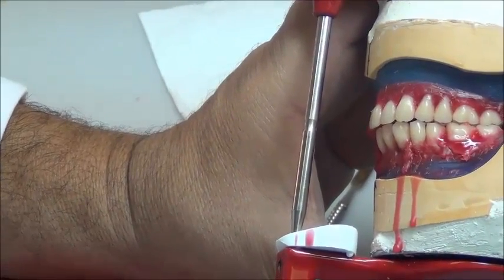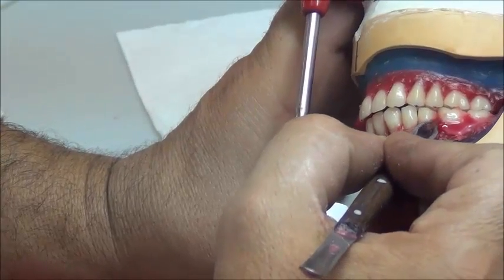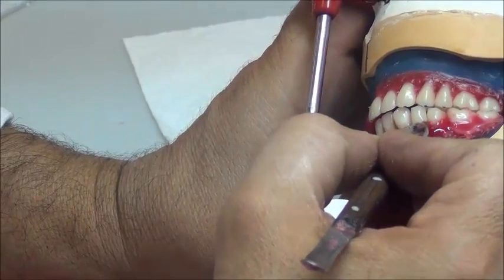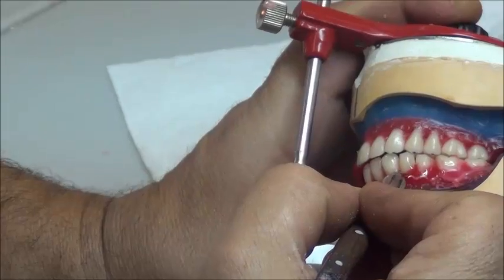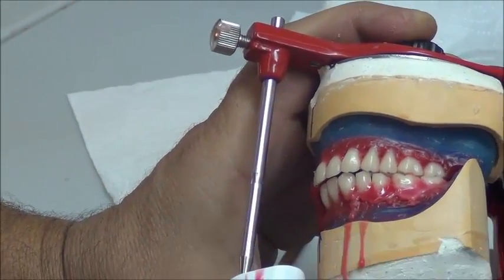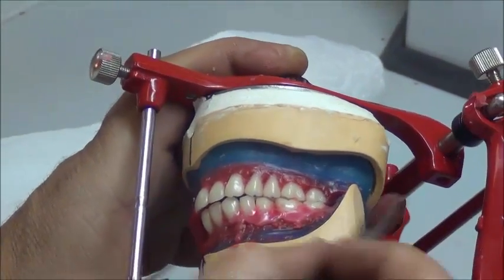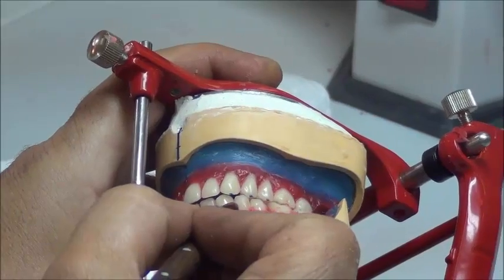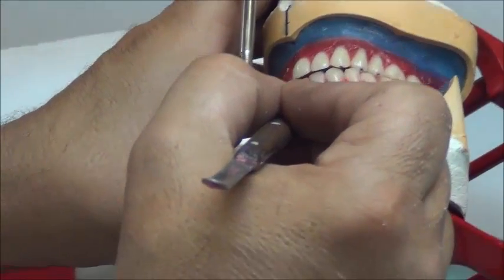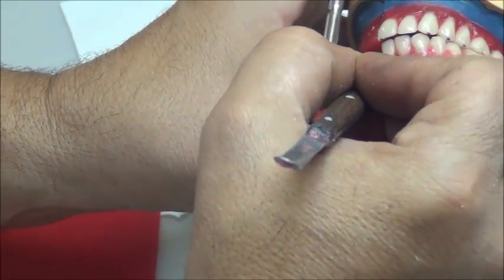Fix them into place securely with warm wax. Fill in the interdental papilla areas. Add more wax if needed. Clean the teeth and submit them bilaterally. All teeth are present on both sides.